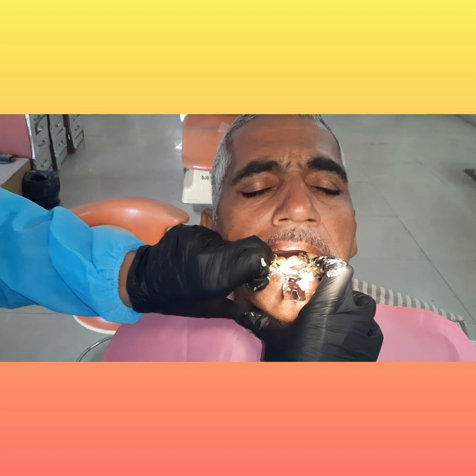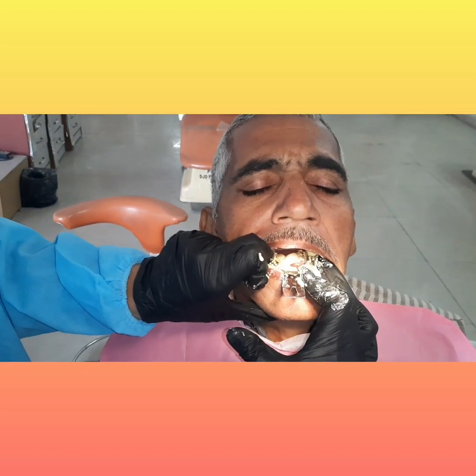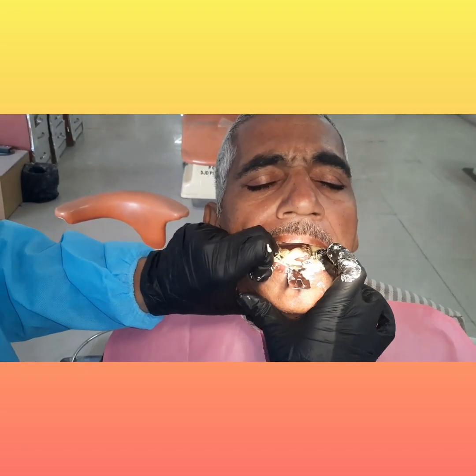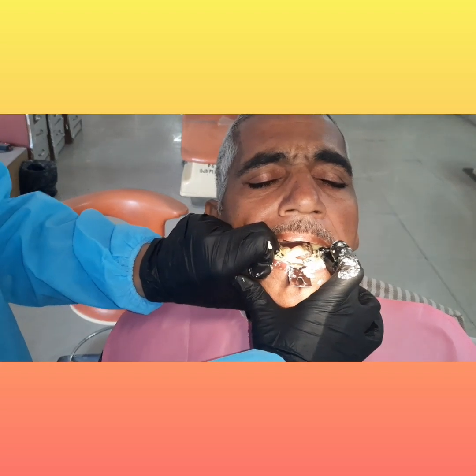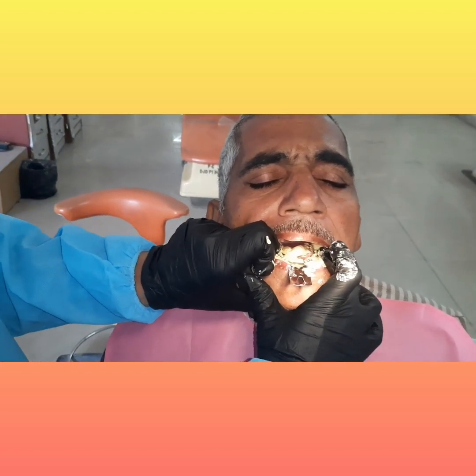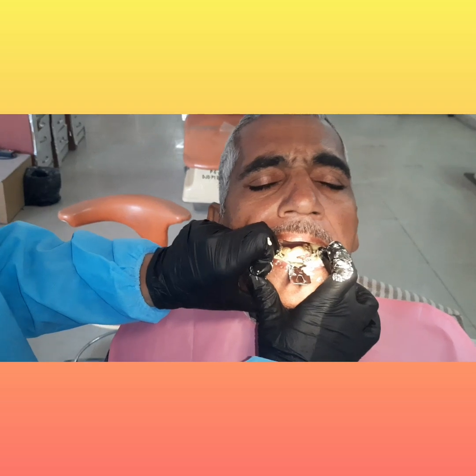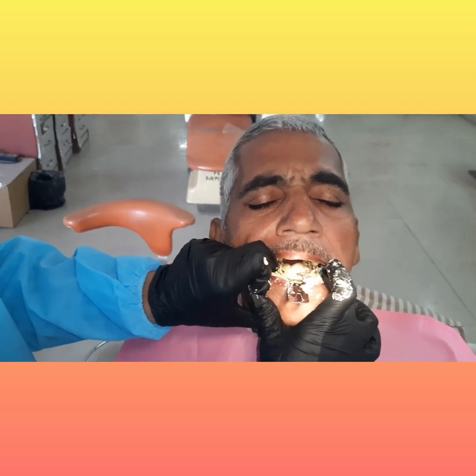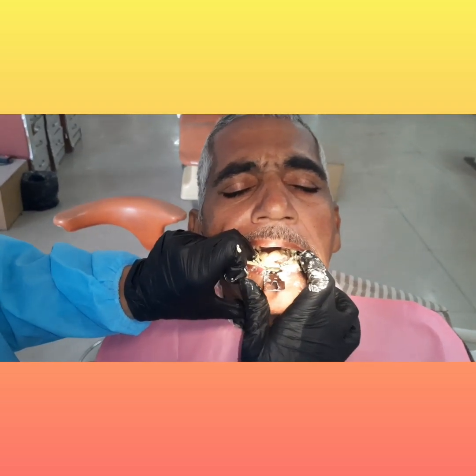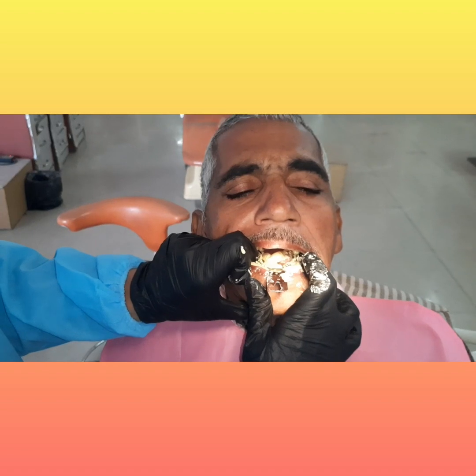Since this is a normal set alginate impression material, the setting time is around 2 to 4.5 minutes. There is another type — Type 1, which is fast set — with a setting time of around 1 to 2 minutes.